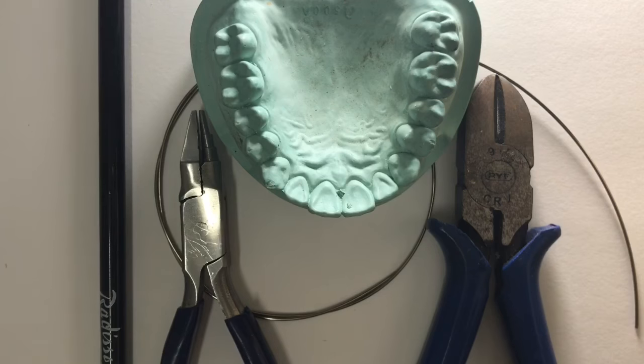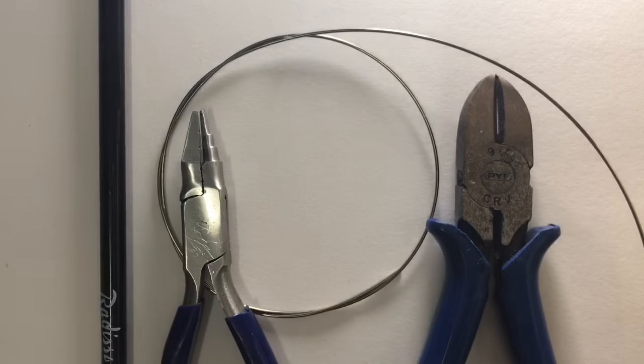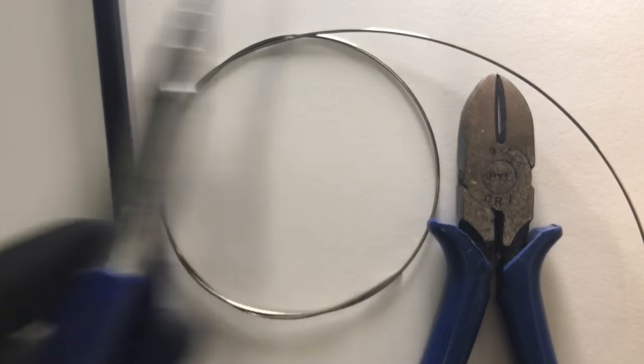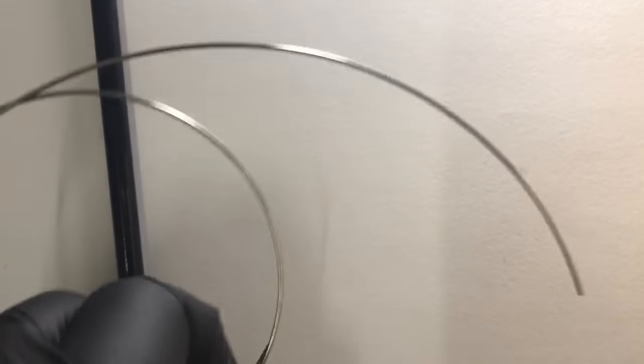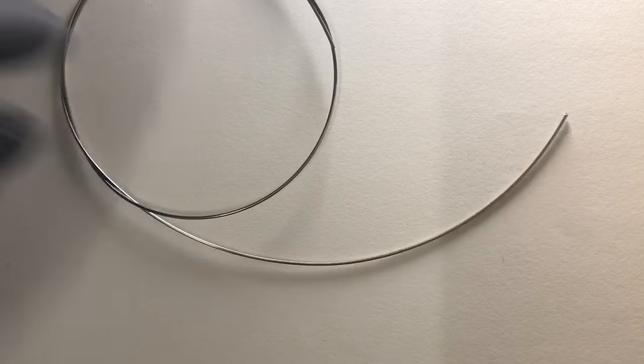Hi friends, today we are going to fabricate a short labial bow on a permanent dentition cast. The things we require are the universal plier, a hard wire cutter, a 21 gauge round stainless steel wire, and a marking pencil or marking pen.